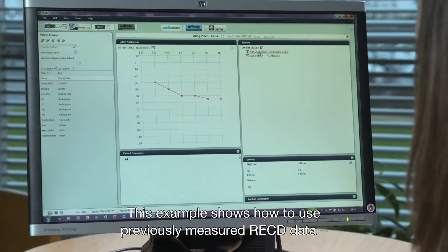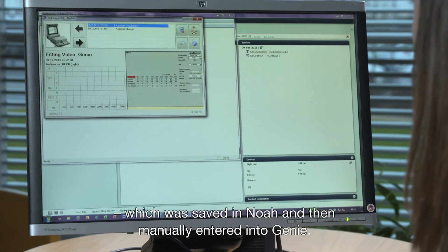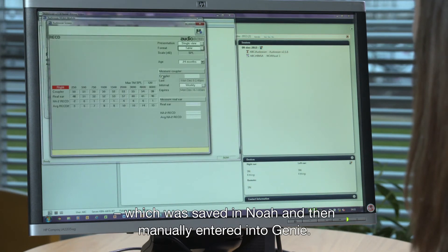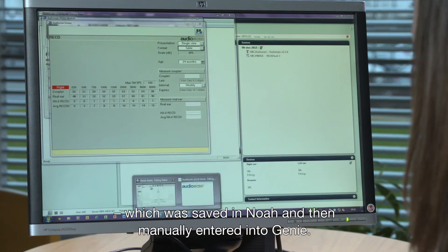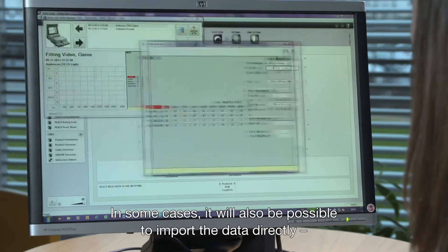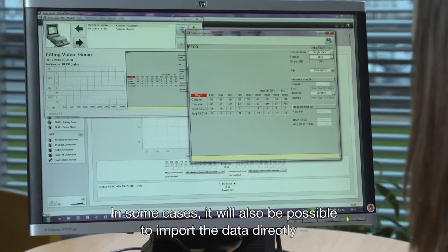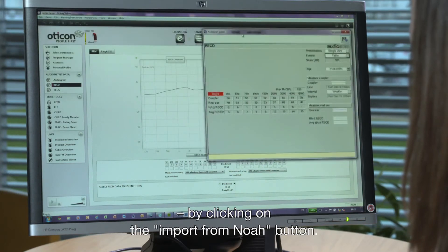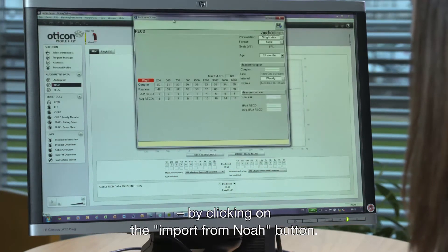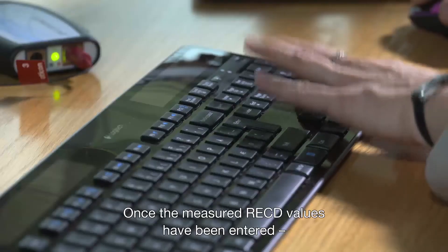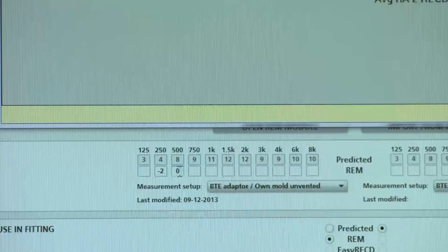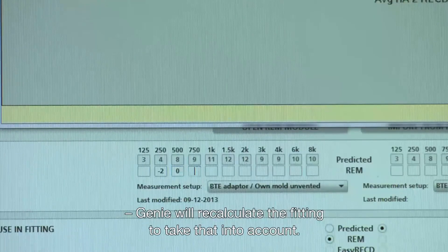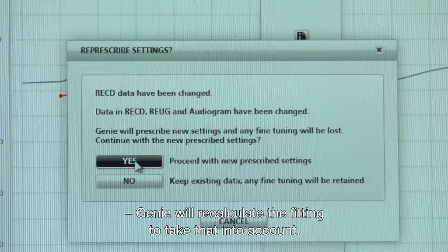This example shows how to use previously measured RECD data, which was saved in NOAA and then manually entered into Gini. In some cases, it will also be possible to import the data directly by clicking on the Import from NOAA button. Once the measured RECD values have been entered, Gini will recalculate the fitting to take that into account.